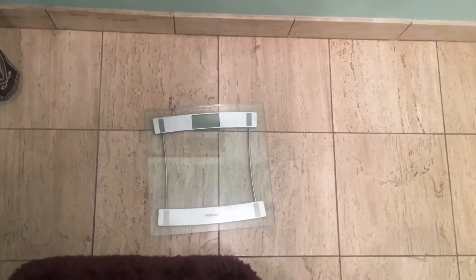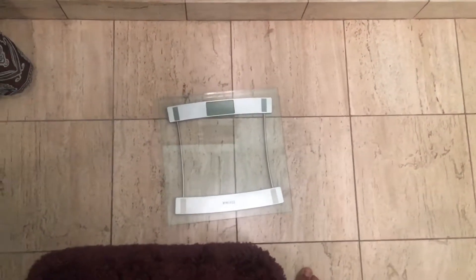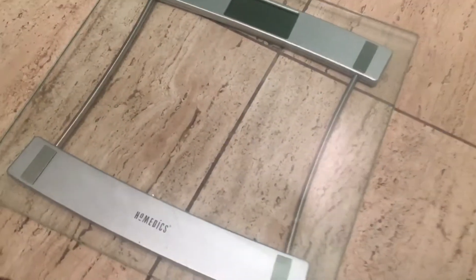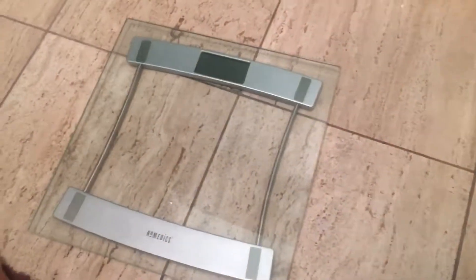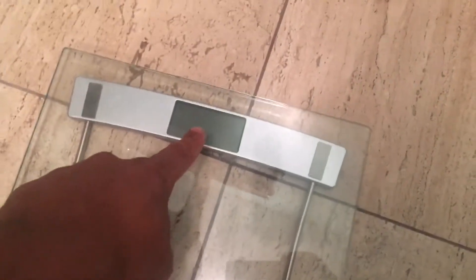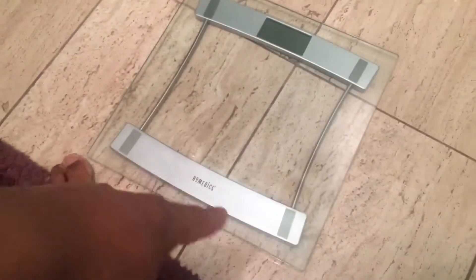This is a scale. I'm going to show you how to weigh yourself. A lot of the newer scales are electronic. This one is made by Home Medics — it's a quite functional and very popular scale. It has a display on the top as well as electronics underneath.